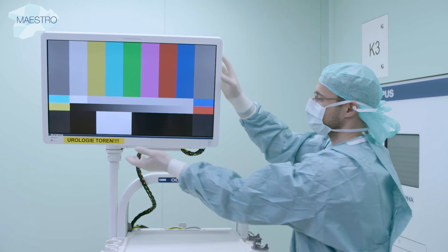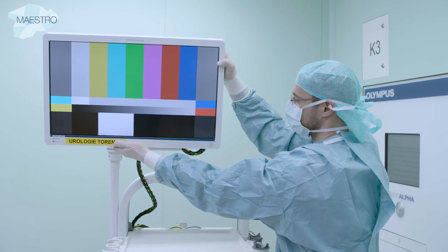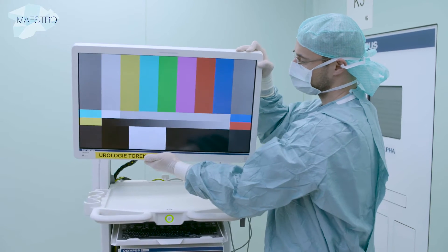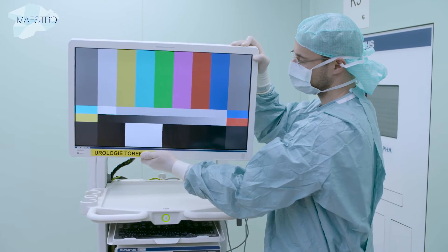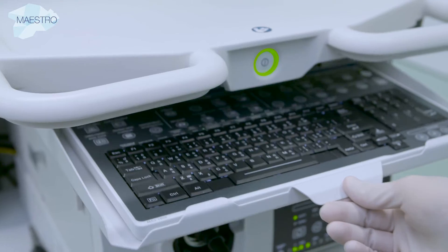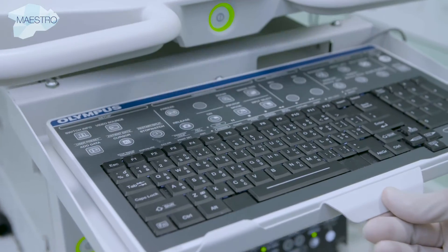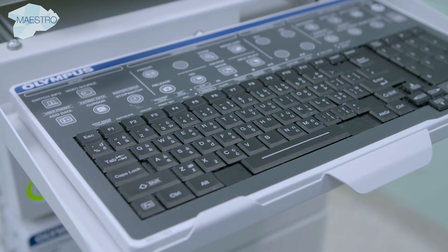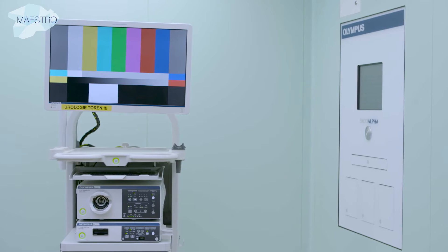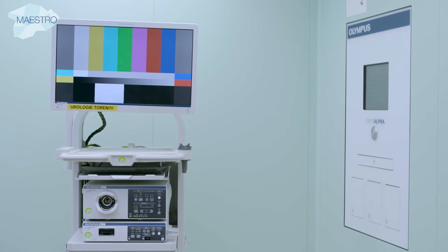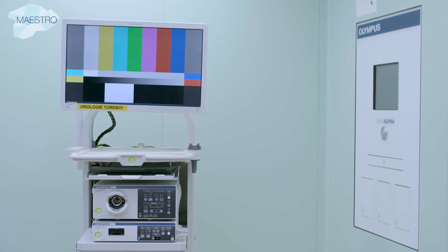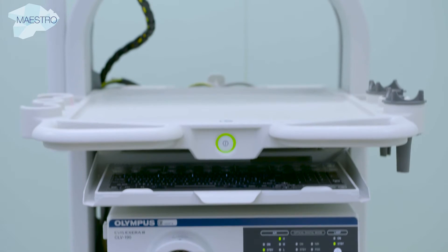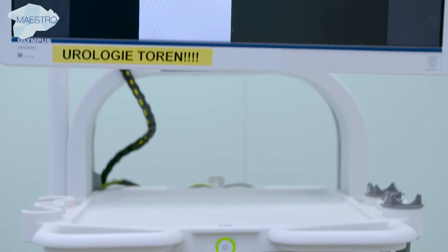The flexible monitor can be adjusted according to the needs of the surgeon. Data input is managed via a keyboard. The light source, video processor, and medical monitor comprise the imaging chain for endoscopic procedures and are the core elements for visualization.